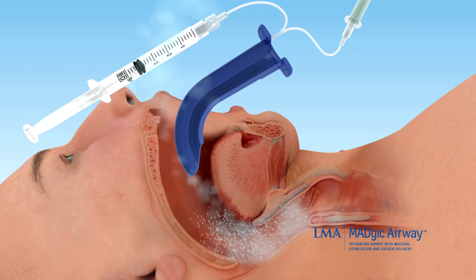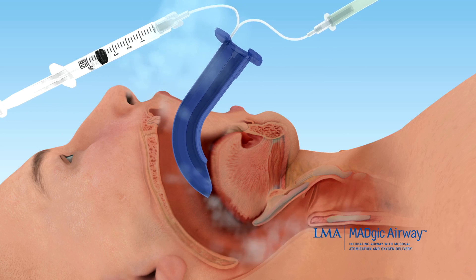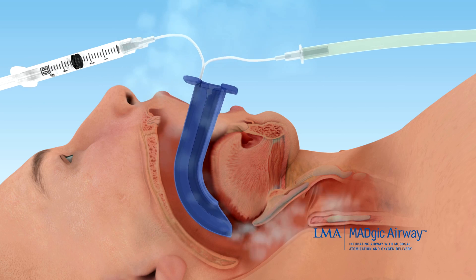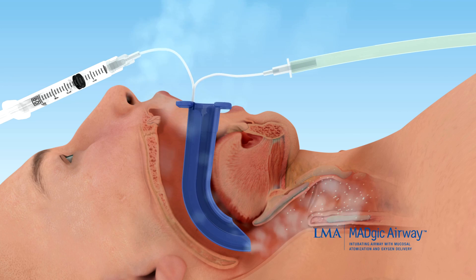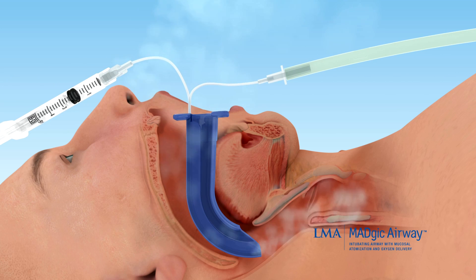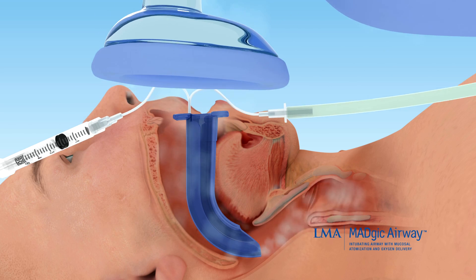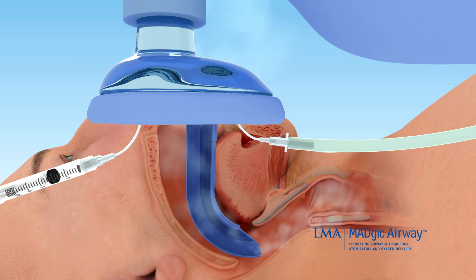Now slip the Magic Airway past the tongue and atomize additional anesthetic into the hypopharynx, spraying as you go until the airway is tolerated. The distal oxygen delivery helps maintain saturation and can also provide for passive oxygenation in sedated patients. You may also place a mask over the patient's face and deliver additional oxygen or assist patient ventilation.